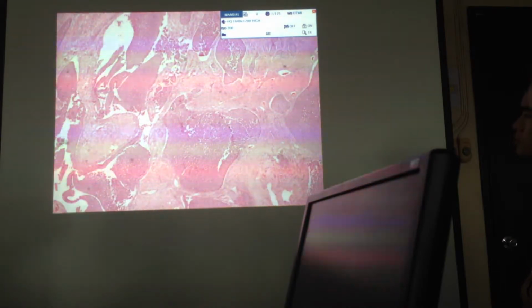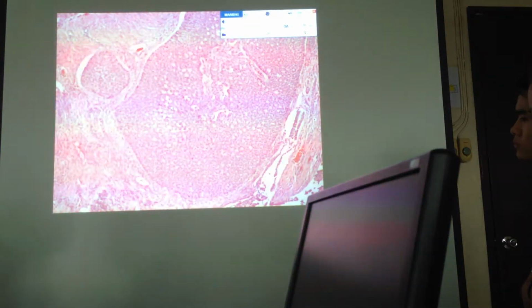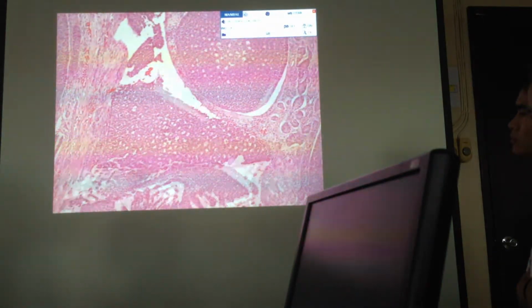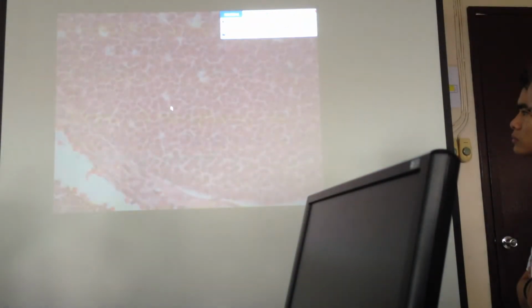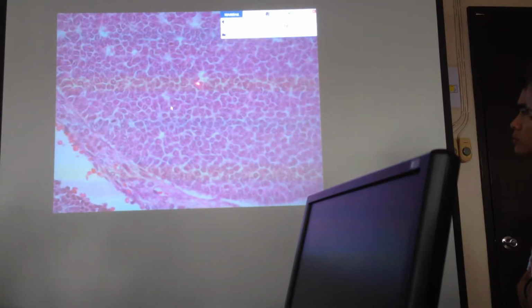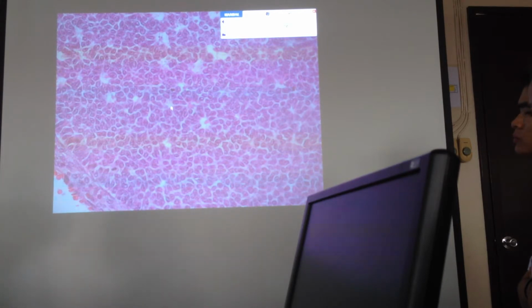And then within the nests, you would see something that's very typical of granulosa cell tumors. You have small follicles of the tumor cells, which would be called the Call-Exner bodies. Okay? Called Exner bodies. C-A-L-E-X-N-E-R. Okay? Called Exner.